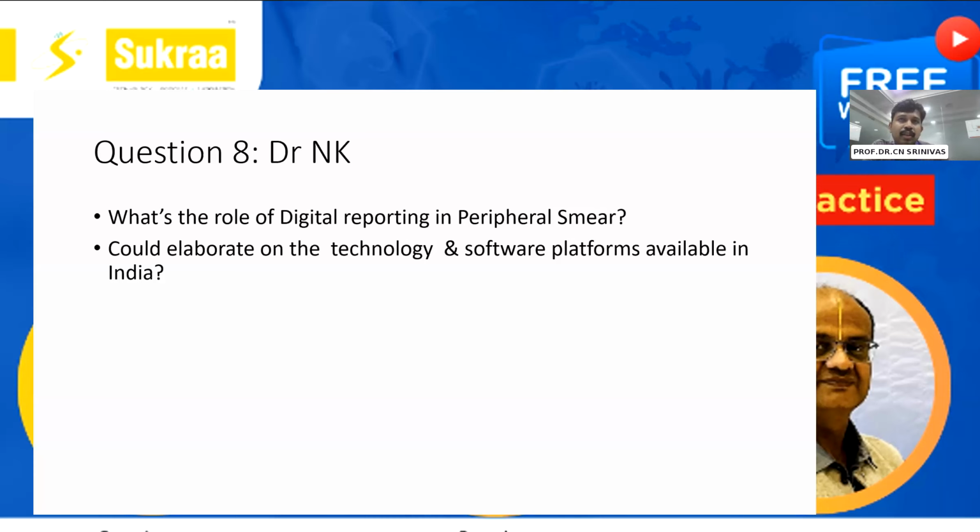This is a value add wherein it can collaborate with the analyzer findings, such as whether the MCV is correlating with the actual classification of microcytes or not.